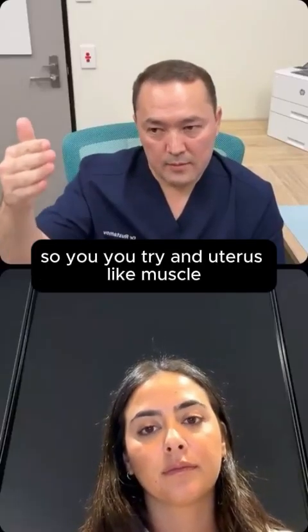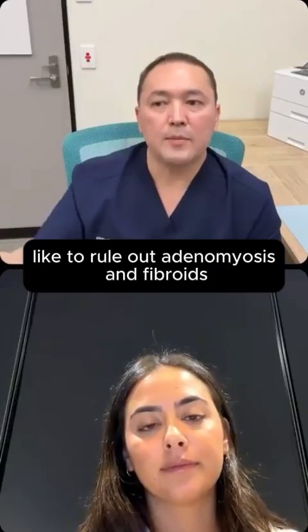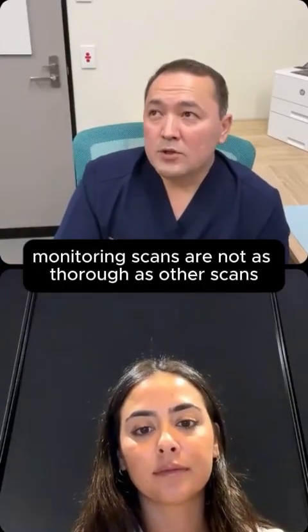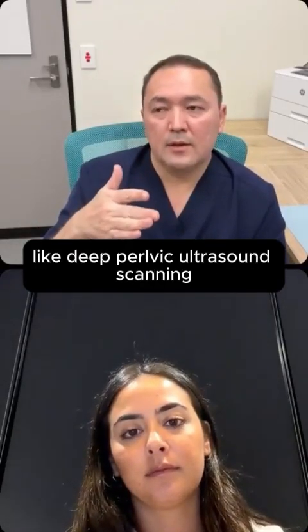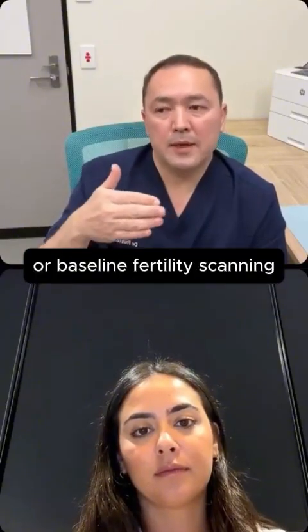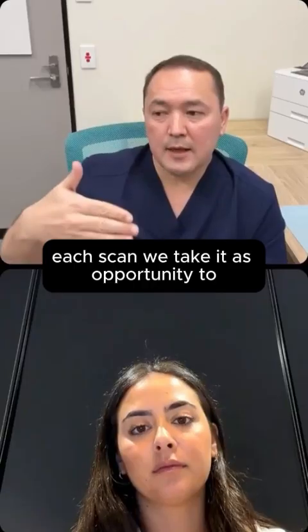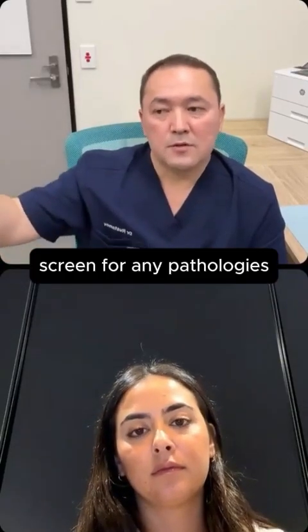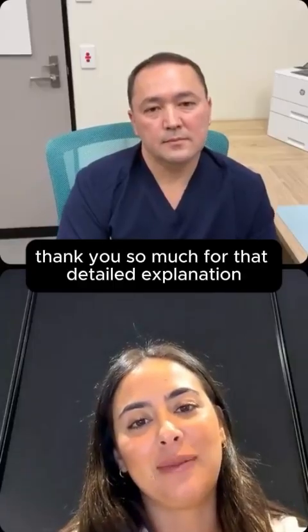So the uterus, like the muscle, to rule out adenomyosis and fibroids, and the endometrium as well. Monitoring scans are not as thorough as other scans like the deep pelvic ultrasound scanning or baseline fertility scanning, but again, each scan we take as an opportunity to screen for any pathologies which might not have been detected in previous ultrasound scans.